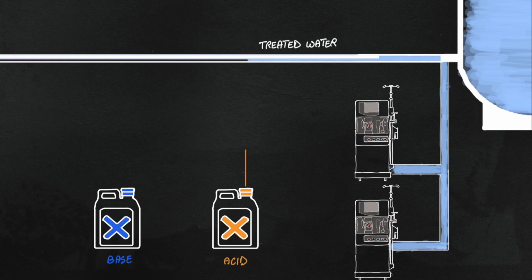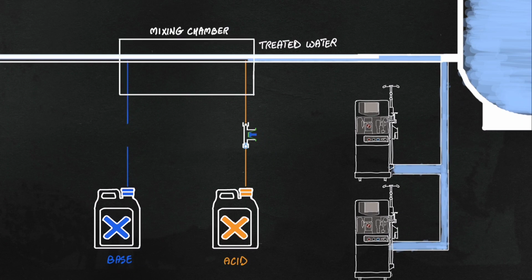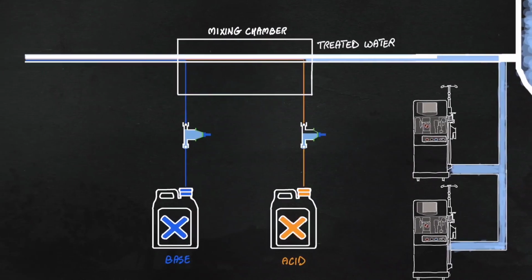Purified water then is pumped to individual dialysis stations, where online, on-demand dialysate production takes place at time of treatment. Dialysate production happens in the dialysis machine using a proportioning system where water and electrolyte concentrates are mixed to produce dialysate. The mixing occurs in the dialysate circuit by adding specific parts from acid and base concentrates to water. It is also warmed and deaerated during this process.